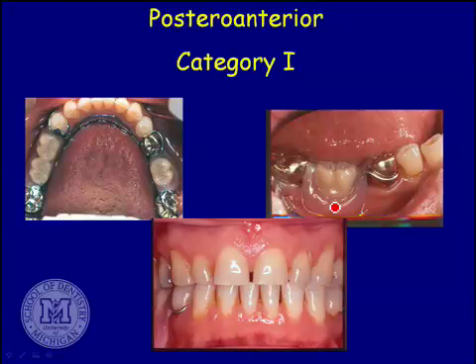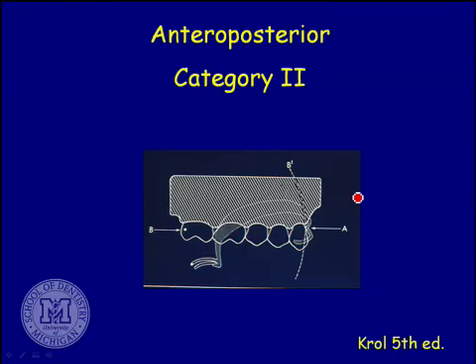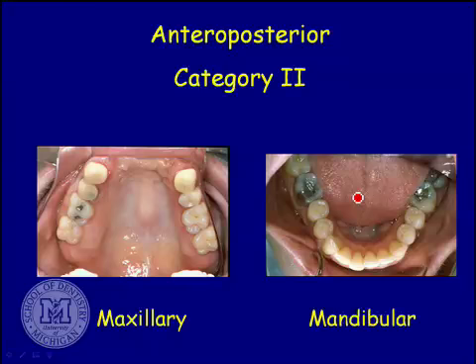We go ahead and get the teeth set up on that. So right away here, you see it's all processed. You've just got this elongated strap rest on the posterior molar. You've got a clasp up front, so this seats, rocks forward, clasp goes down. So as long as this is seated, the back part can't pull out, front to back. You look at these many times, these class 4 situations. Here's your lower arch.